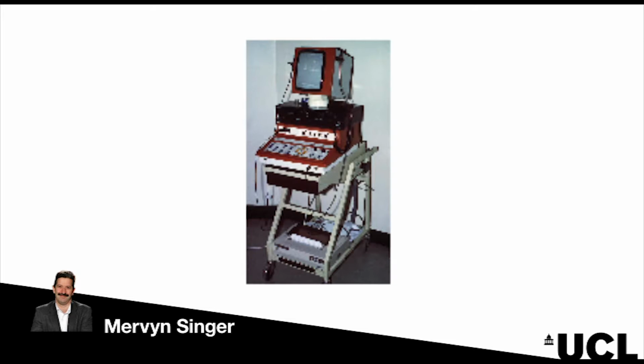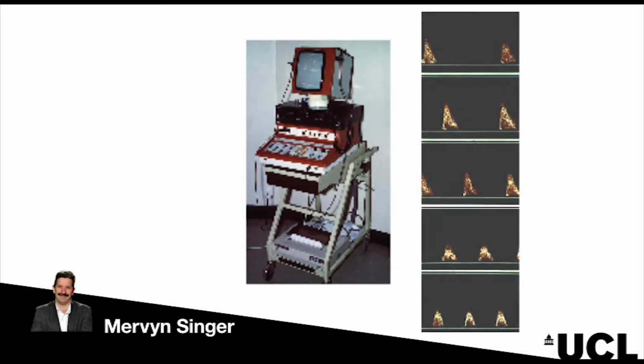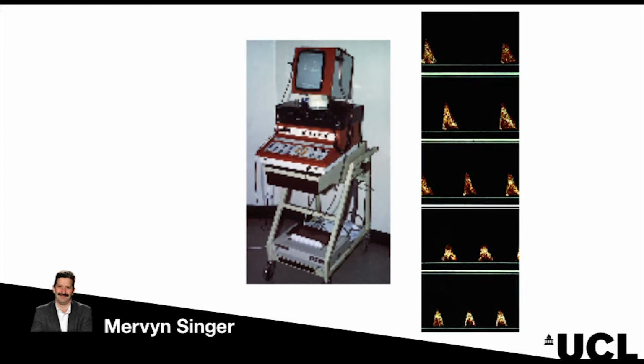So you could look at the width of the waveform, the height, and the area under the waveform, which, as I mentioned earlier, represents the stroke volume. And shown now on the right-hand side of the slide is another example of a patient in complete heart block, but now it's in glorious Technicolor. And again, you could optimize the heart rate to the best stroke volume.